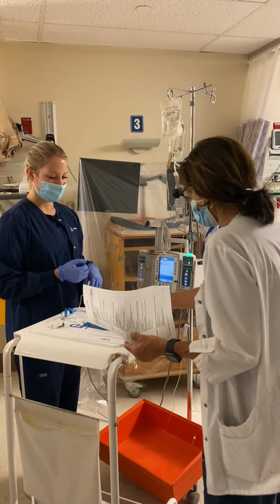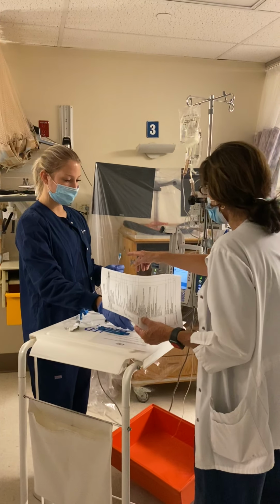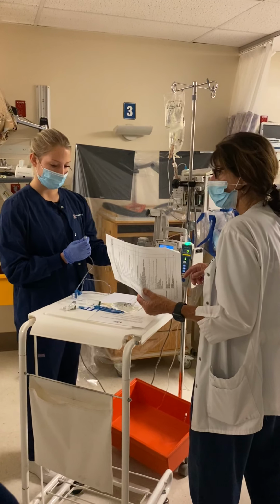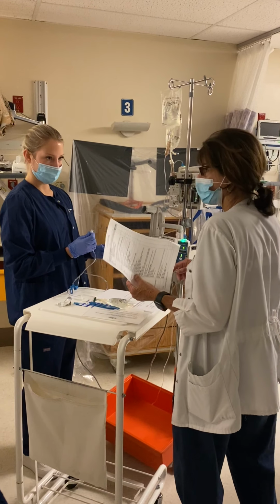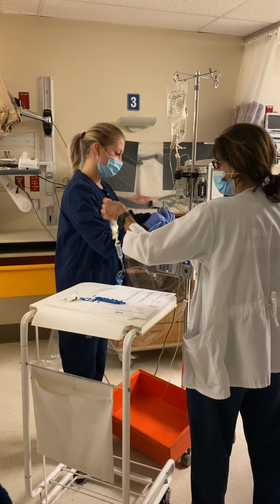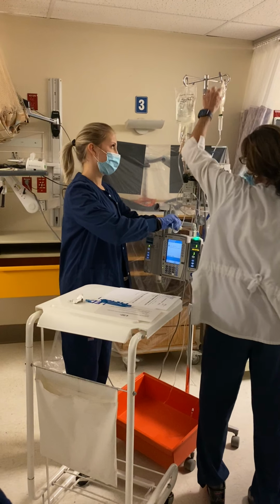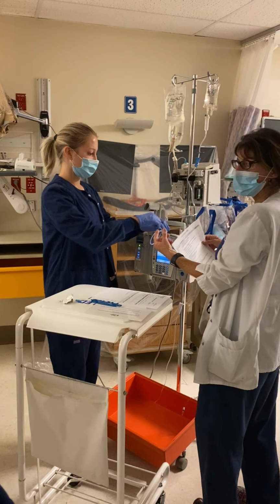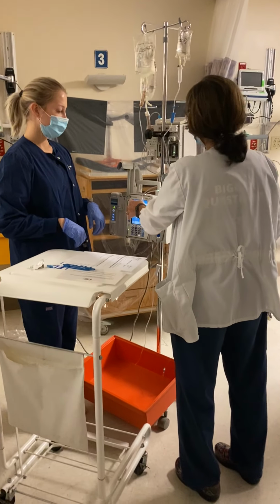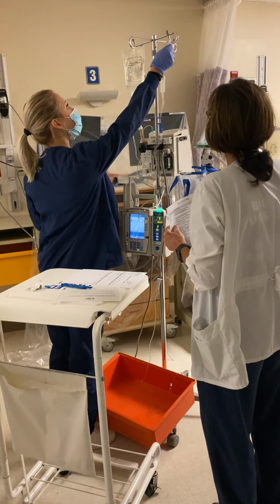Okay, perfect. And then again, you don't want to contaminate the end of this. So you're going to take your blue cap off. While you're scrubbing, would you hold the end of that so it's not laying on the table? Again, it might be easier if some students had this hung while scrubbing, with the cap on it, just as long as it's not contaminated. And so now you have it plugged in, and now you're going to have to take it down because you're going to back prime.